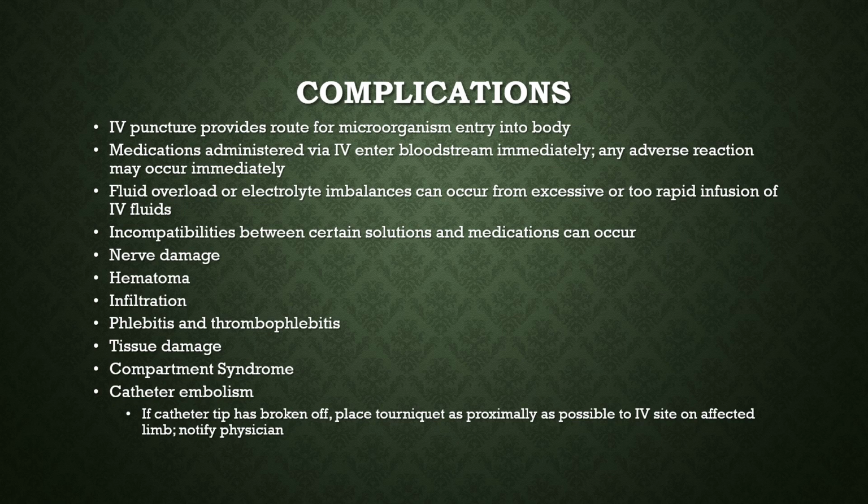Nerve damage, hematoma, infiltration, phlebitis, thrombophlebitis, all things that can happen as a complication of an IV. So certainly when you're sticking somebody, you can damage a nerve. And hematoma is just a pocket of blood under the skin that becomes a bruise.